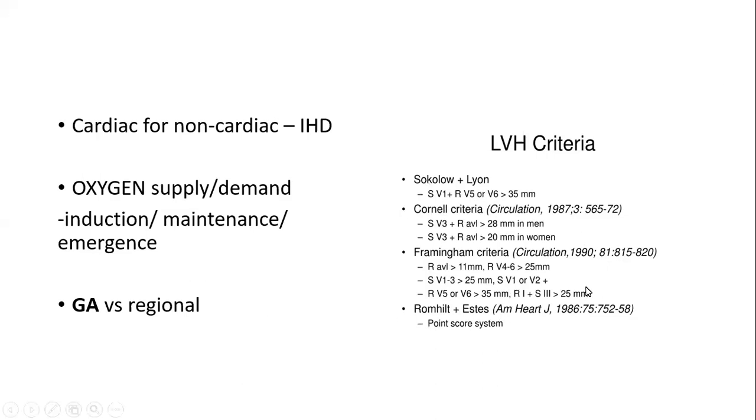And then Kakamba mentioned which criteria she uses for left ventricular hypertrophy. Whichever you use, be able to diagnose left ventricular hypertrophy. And what are the implications? Because, like I said, the point of the exam is not only for you to pick up an ECG. You need to know the anesthetic implications, because the question will be either what are your anesthetic concerns, or how would you manage whatever situation is there.